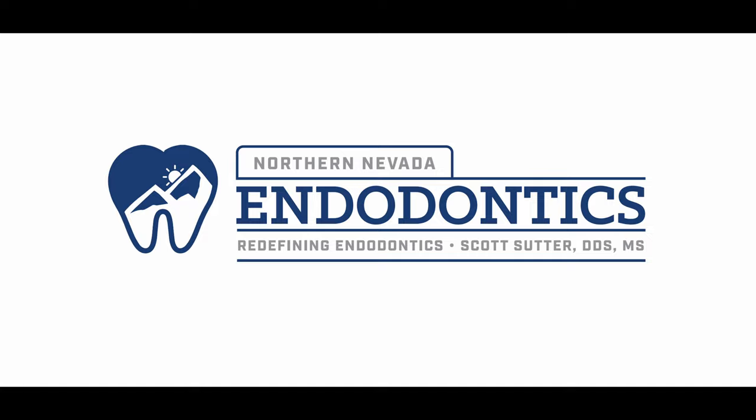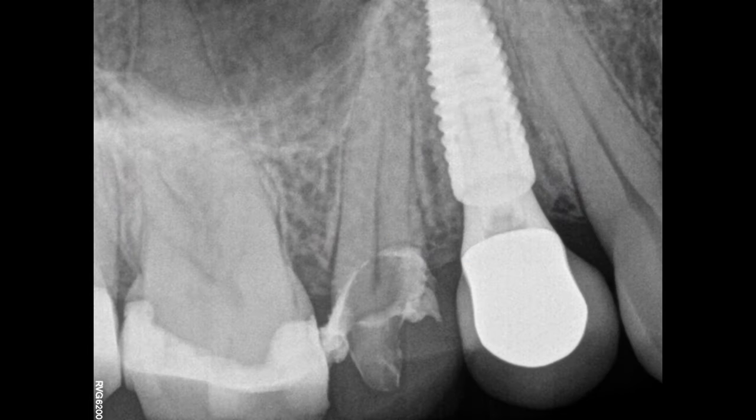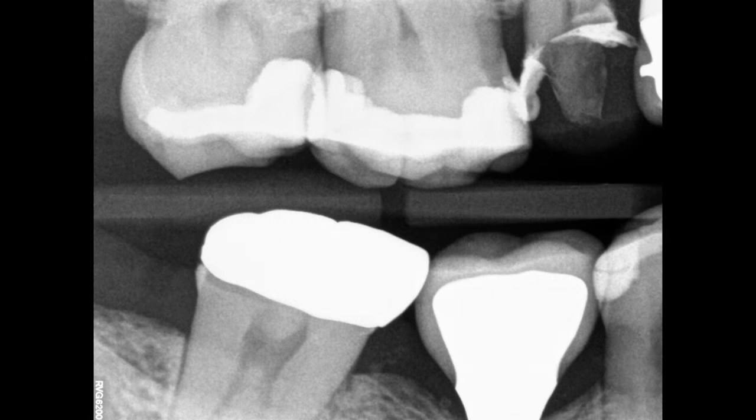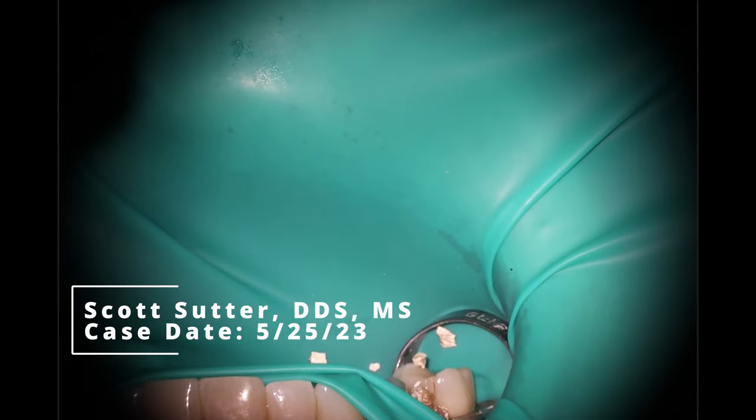Hello everybody, we got a fun one for you today. I received a text message from one of my best dentists saying he needed me to help save a tooth. He was prepping it, got caries into the pulp tissue, as you can see there. And he told me to quote, make it look pretty like you did the last time.